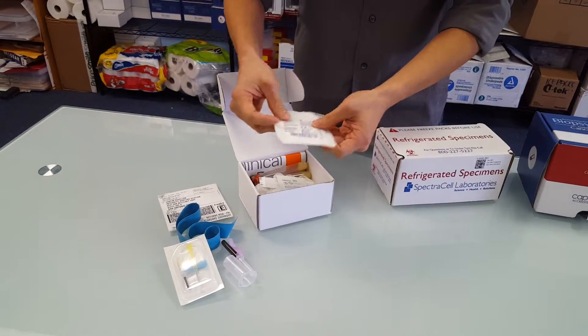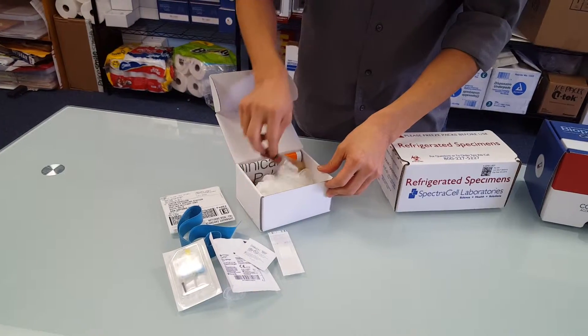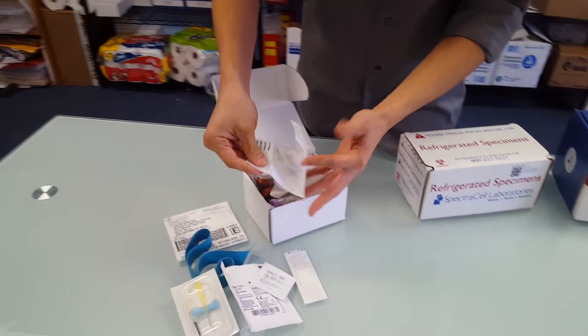This is a gauze strip, band-aid, rubbing alcohol, a pair of gloves, your tubes. These are labels for the tubes.